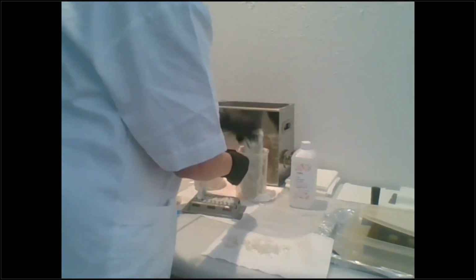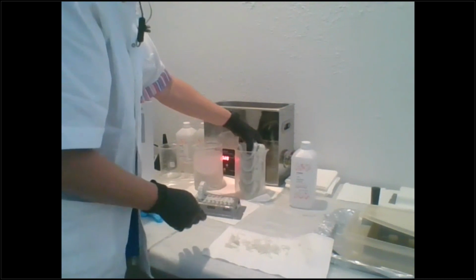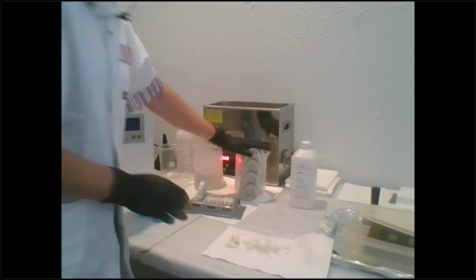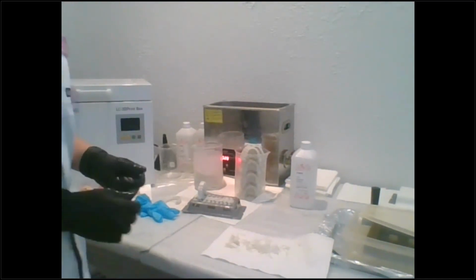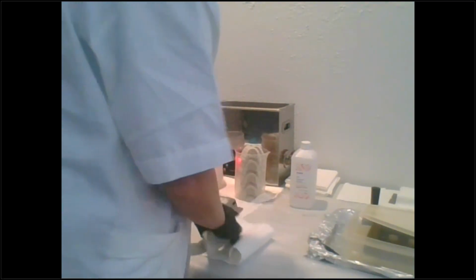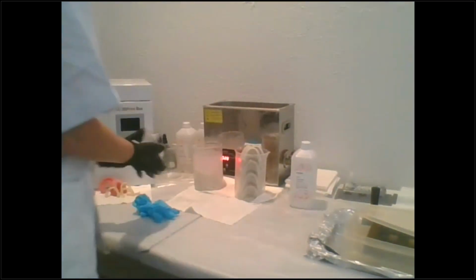Okay. So again, you would just fill that with alcohol. On my second bath, I would change the orientation of them, fill that, do my 2 minutes, okay? Then, very important to remember is you want to make sure that all of your models dry.